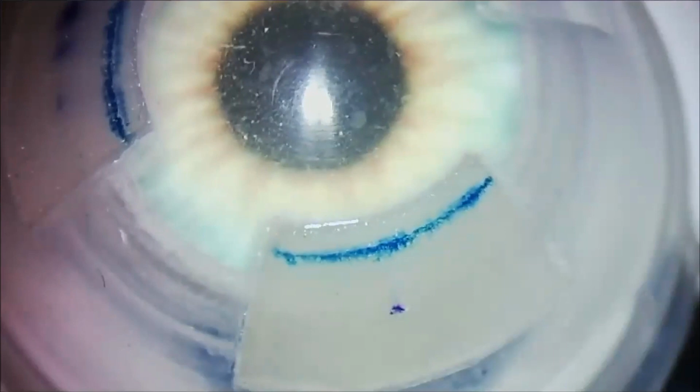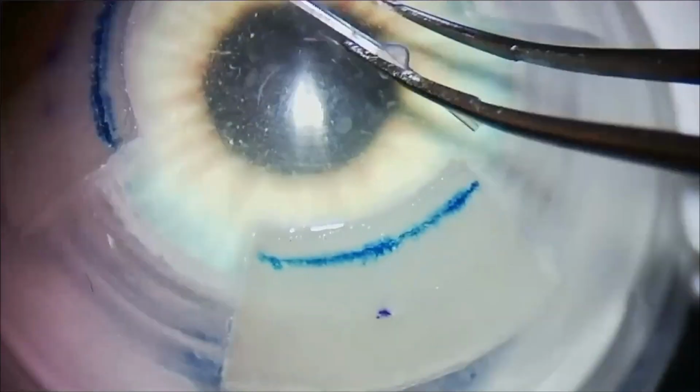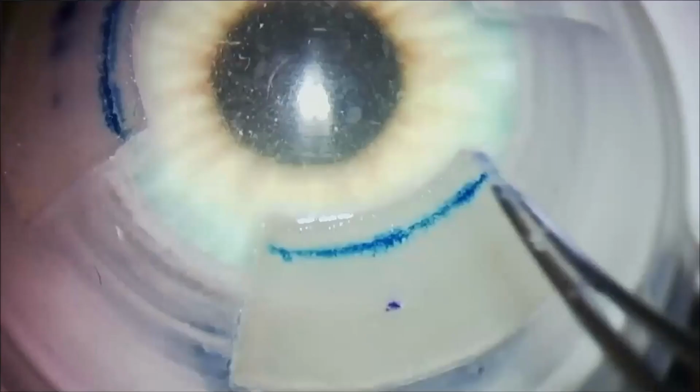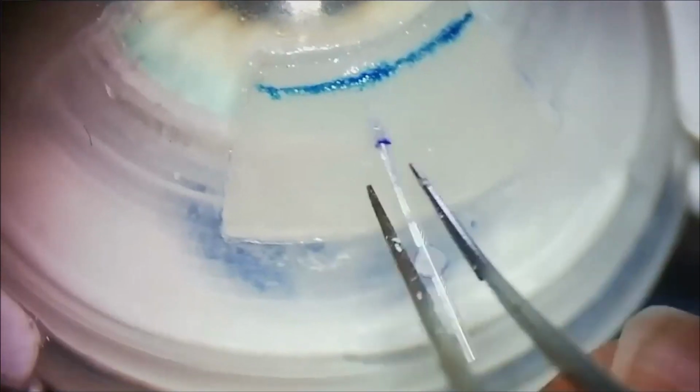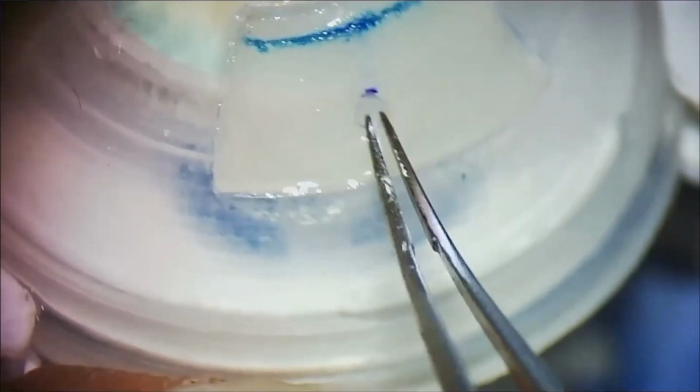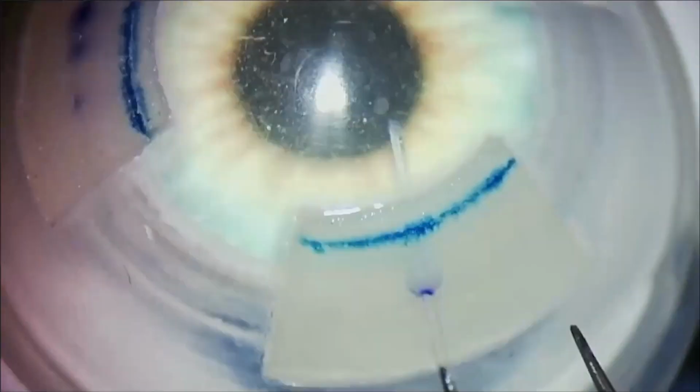You'll take the actual microshunt now, and you'll get a feel for how it is to grasp it with a non-tooth forceps and sort of how much give the device has. And you'll want to then insert it bevel up into the track. And again, sometimes you have to be a little careful. It can be a little bit more challenging to actually insert the tube depending upon sort of how you make the track.